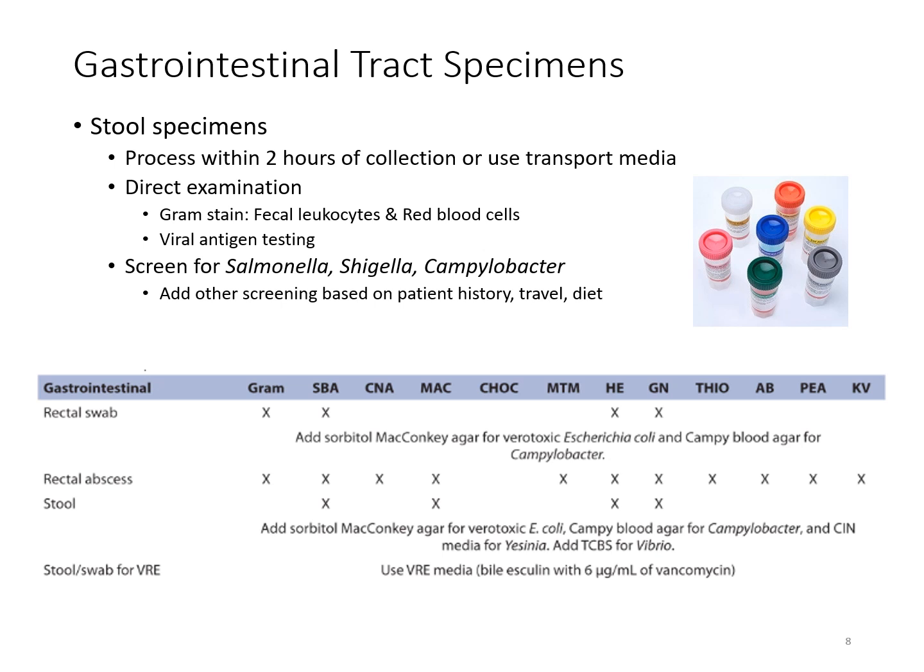But here you've got this list. Again, refer to your site. Don't go by this list, but this just kind of gives you a general idea of what you will use to culture these particular specimens.